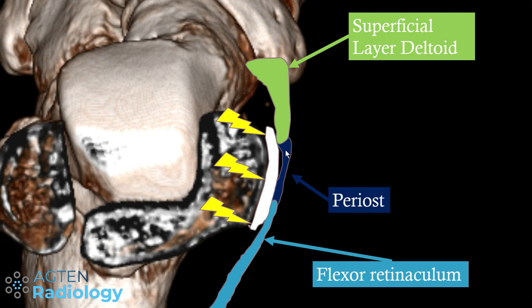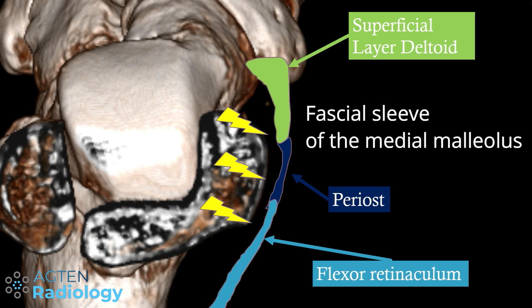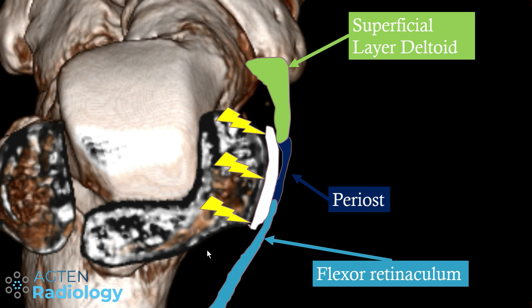Typically what you then see on MRI is some fluid in between this dark structure and the bone, basically below the periosteum. These three structures are in continuation, and this fibrous sheath has also been termed the fascial sleeve of the medial malleolus. If you have this kind of injury you can call it an avulsion or stripping of the fascial sleeve of the medial malleolus. Importantly, if we have this stripping and the posterior tibial tendon is nearby, we might actually have an instability of the posterior tibial tendon.